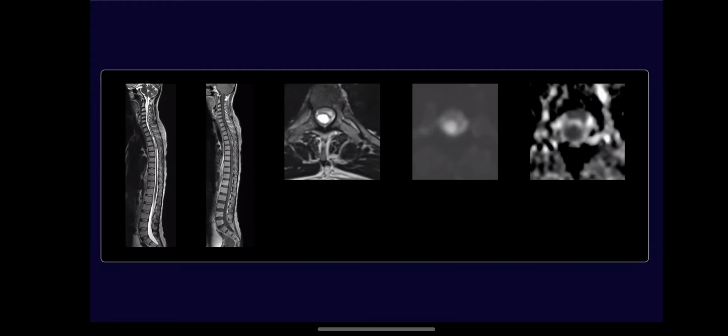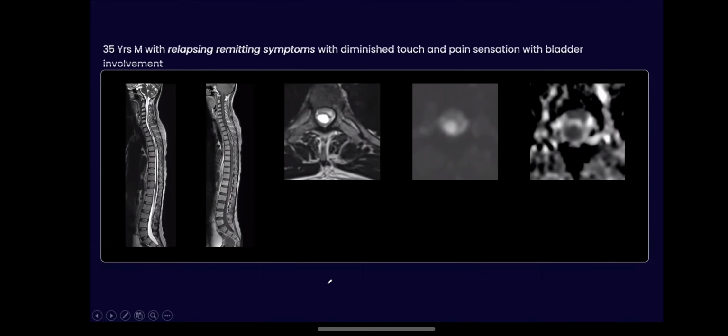Of course, I would say that in the Indian subcontinent, it's not a very atypical infection. We do see involvement of the spinal cord by brucella quite often. So it's not really that atypical. So yeah, like I said, this was one of those cases of brucella involving the epidural component.